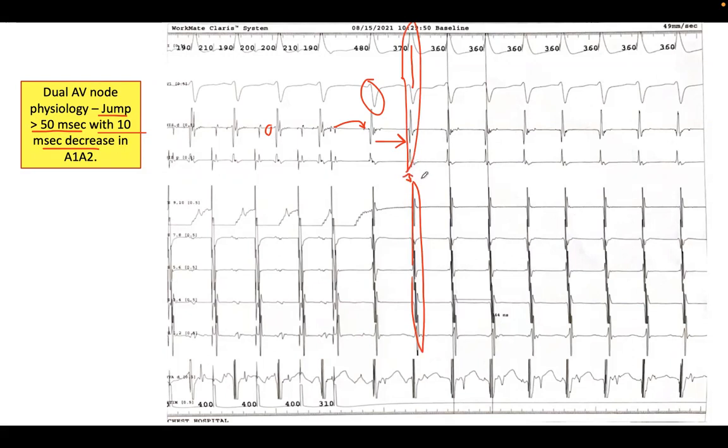Of course, like we said, long has to be very long. In order for long to be meaningful, when I say long RP tachycardia, I usually mean that it's 50% beyond the RR interval, and somewhere here. Okay, your A's. But that's a tachycardia that started with the atrial pacing. I'll tell you that this was a jump and a very short VA interval, less than 70 milliseconds. That's typical AVNRT. The earliest A is in your His. Okay, guys, that's typical AVNRT until proven otherwise.